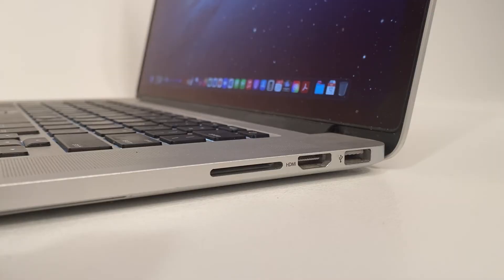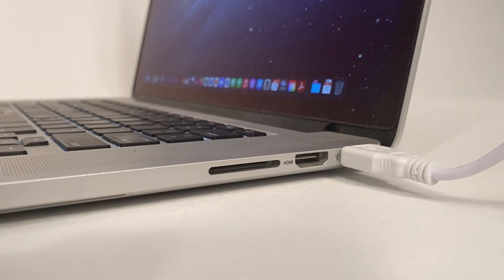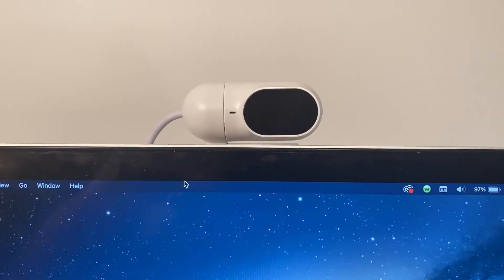Plug the Tracker Pro 2 into an available USB-A port on your device. The power status LED on the Tracker Pro 2 will turn red.